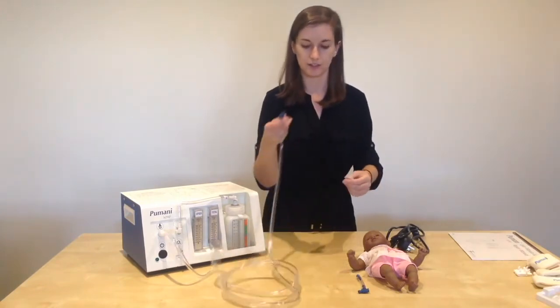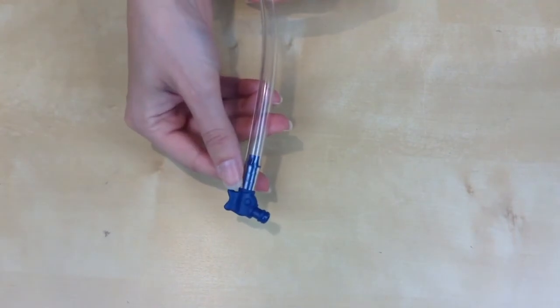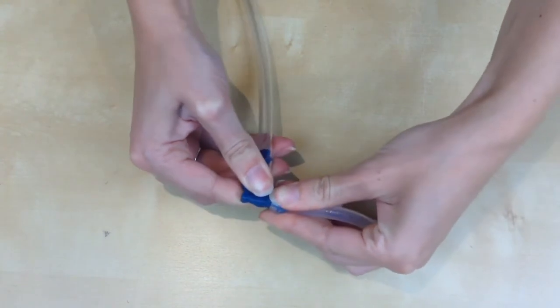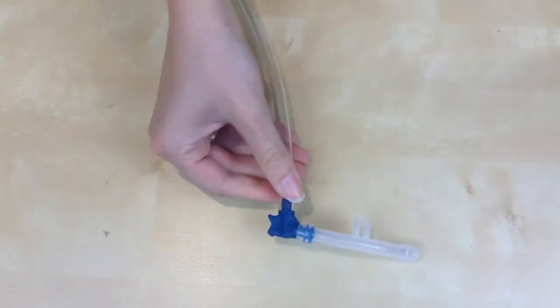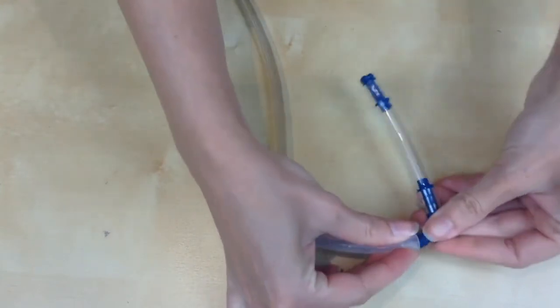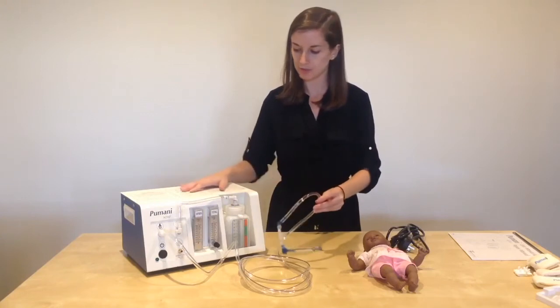Place the other prongs to the side. On the end of the patient tubing you have the fish elbow, which connects to one side of the prong. On the other side you will have your end cap, which attaches to the other side. You have now assembled your machine.